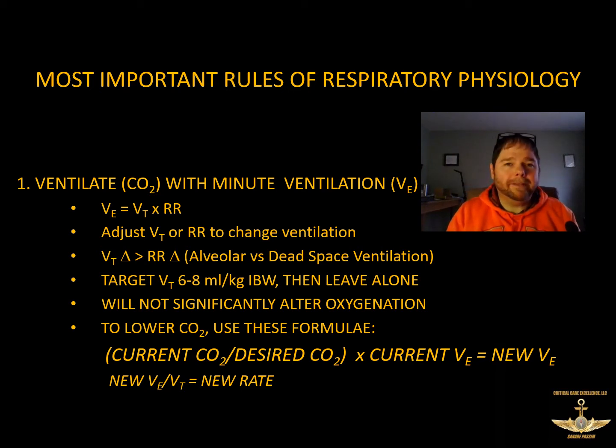And changes you make to the tidal volume typically make a bigger difference than changes in respiratory rate, only because when you make a change to tidal volume, once you exceed the dead space ventilation, which is about 150 milliliters, everything that comes after that is alveolar ventilation. So when you increase alveolar ventilation, you're effectively increasing the surface area at which you exchange gas, which will move more CO2.